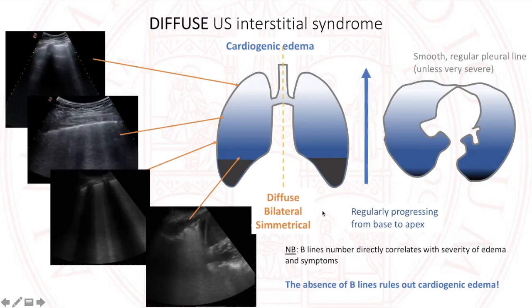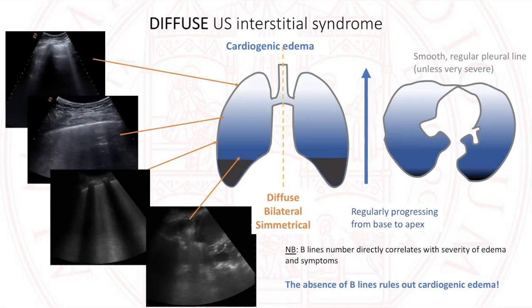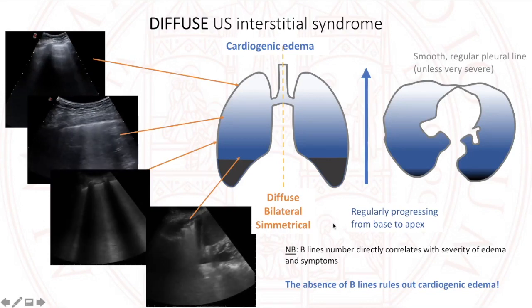It is B-lines, such a sensitive method of studying cardiogenic edema that lung ultrasound could rule out the diagnosis of a severe cardiogenic edema. In a severely dyspnoic patient with respiratory insufficiency, the absence of B lines could rule cardiogenic edema out.